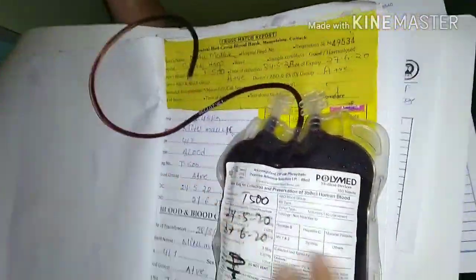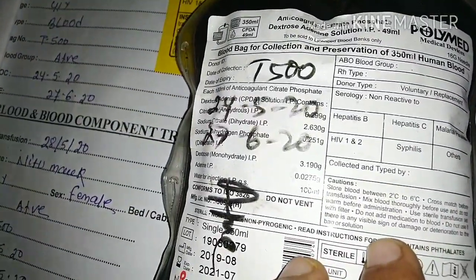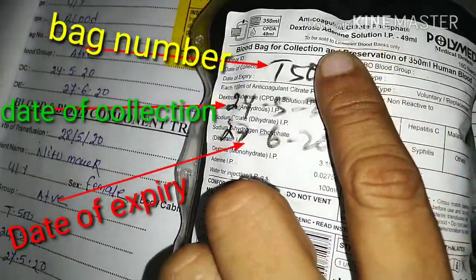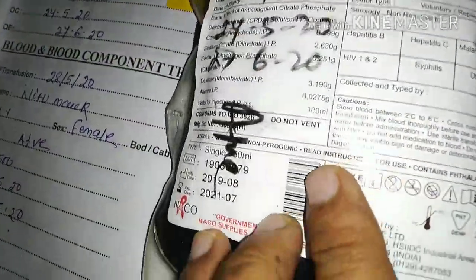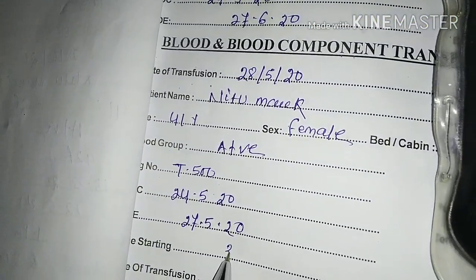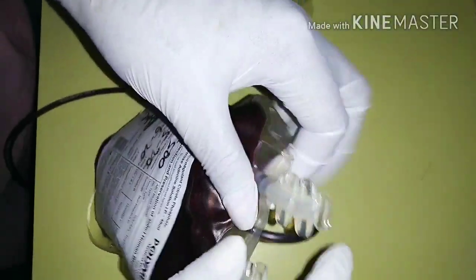Before transfusion, there are three important parts to be checked in the blood bag: number one is the blood bag number, second is the date of collection, and third is the date of expiry. Last but not least, check which blood group it is. After verifying all these things, we must document everything in the file.